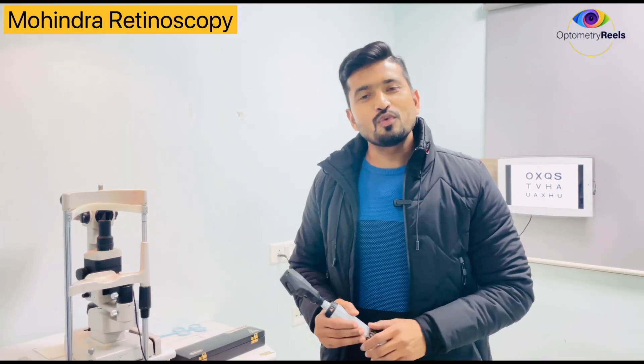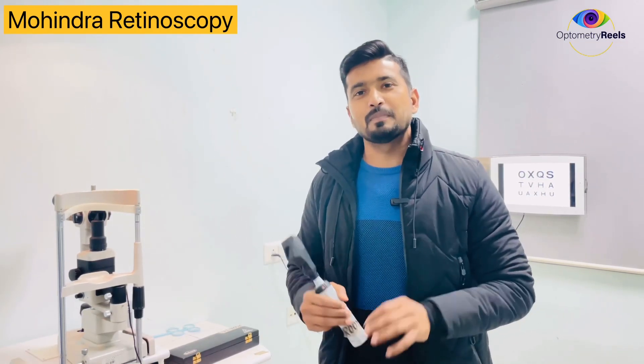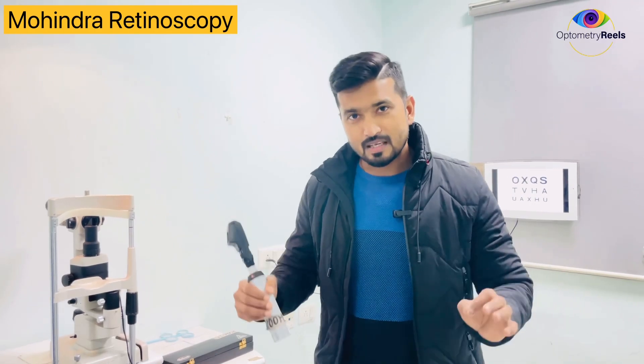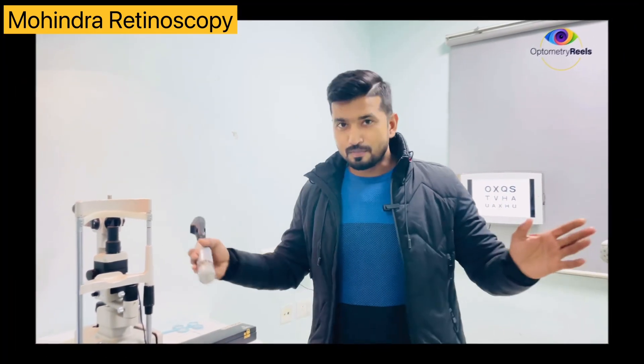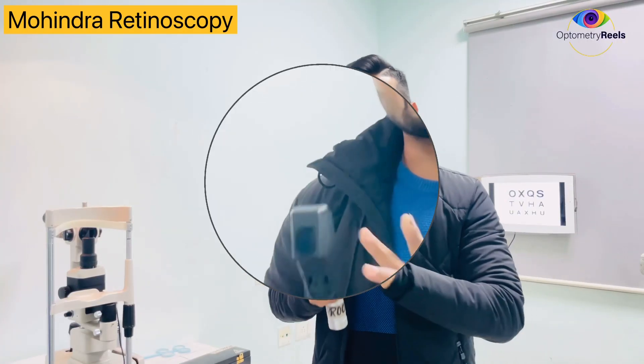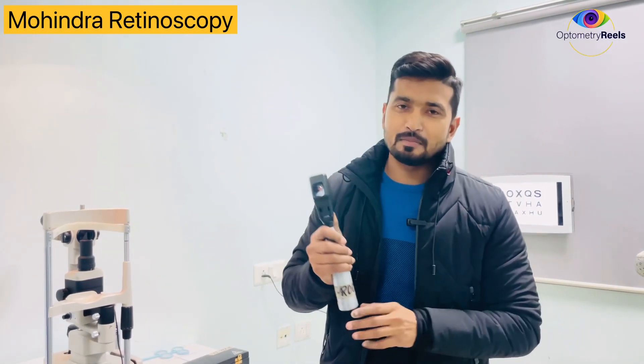This technique is useful for determining the refractive error of the patient. This can be used for all patients, but it is very useful and effective for infants and toddlers. To perform this test the room has to be fully dark, and the fixation target should be the light of the retinoscope. The working distance is 50 cm.